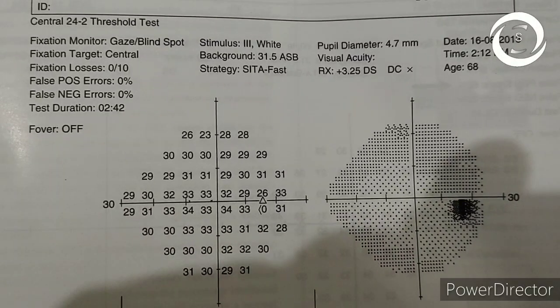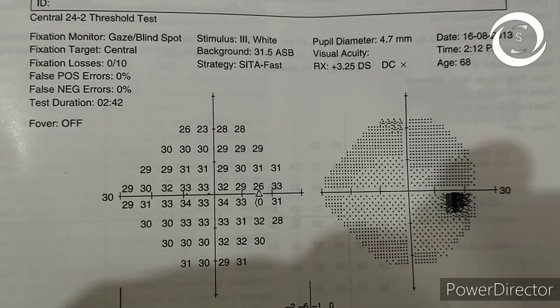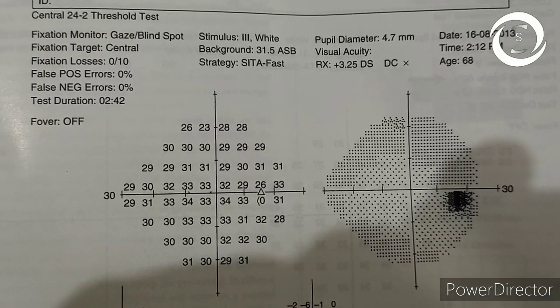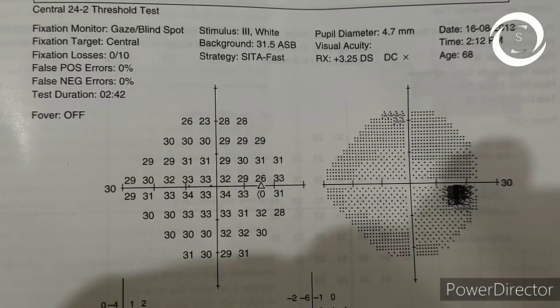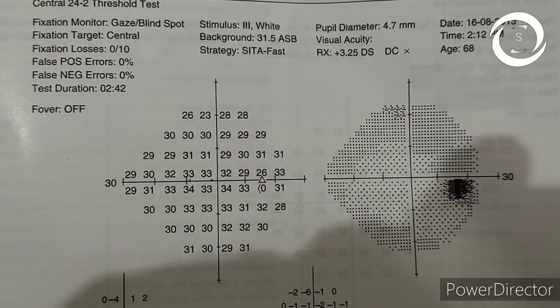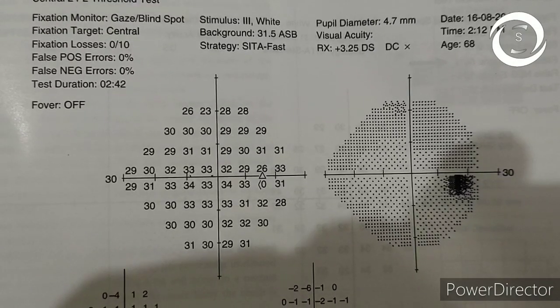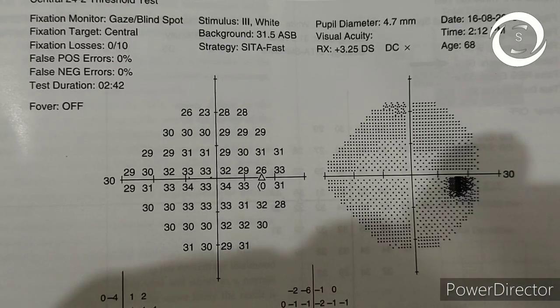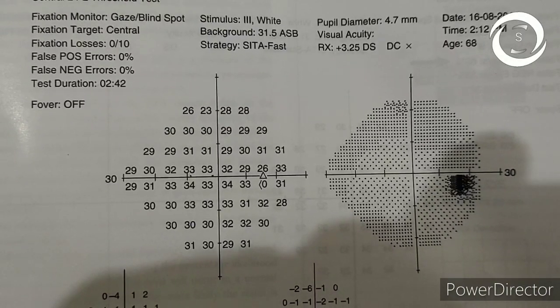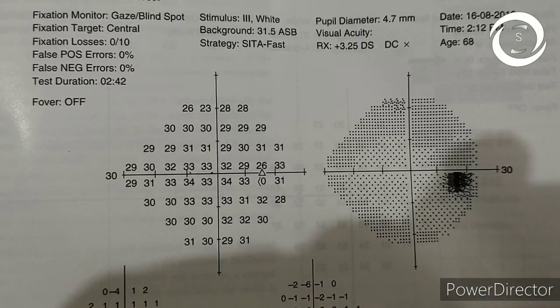I am Dr. Sharjeel and today we will discuss the second video of the series on visual field printouts. Here I am showing you another Humphrey visual field printout, and in this video I will also show you a Medmont visual field printout and an Octopus visual field printout, so you should be able to check the differences between the printouts.